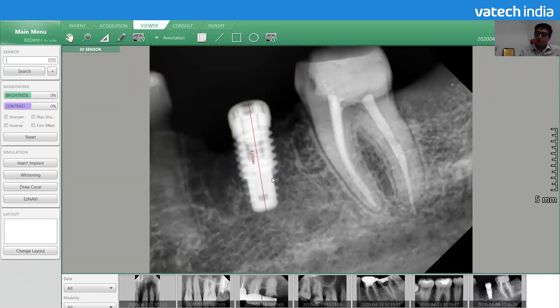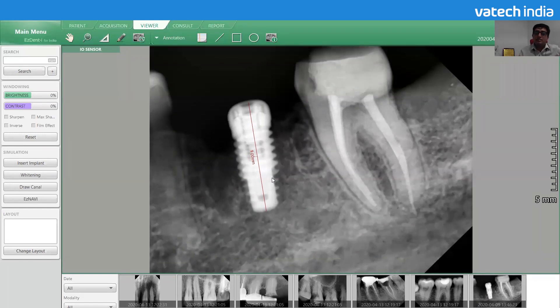Now whatever measurement you take in this X-ray will be accurate and calibrated as per the actual implant length. This is one way to calibrate intra-oral X-ray images.